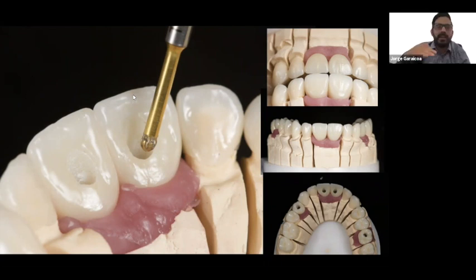So it's a very nice clinical tip to decide, okay, when can I use it? Because if I tell you more than 15, how much is that? How would I measure that? But that makes a lot of sense, right? If you are over the incisal edge and you're on the facial, then it will be too much. For me, it makes a lot of sense because I've done restorations where I had a straight screw, but the incisal edge was so thin that you become really scared to do that, because remember that you don't have much porcelain right there.